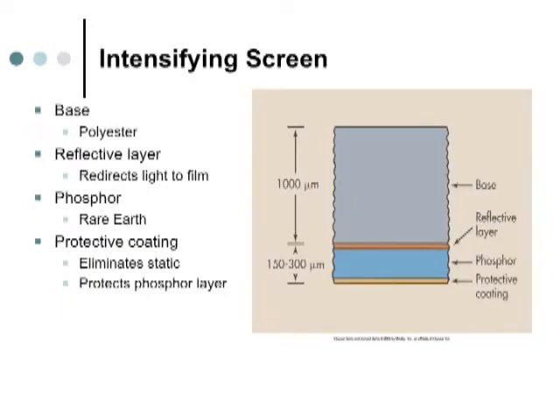So the film is placed inside of something called an intensifying screen. Have any of you ever worked with cardboard holders? Back in the 70s, they had cardboard. I trained on cardboard holders. And cardboard holders is when we take the X-ray film, place it into a light-tight envelope that was made out of cardboard, and directly expose the X-ray film to radiation.